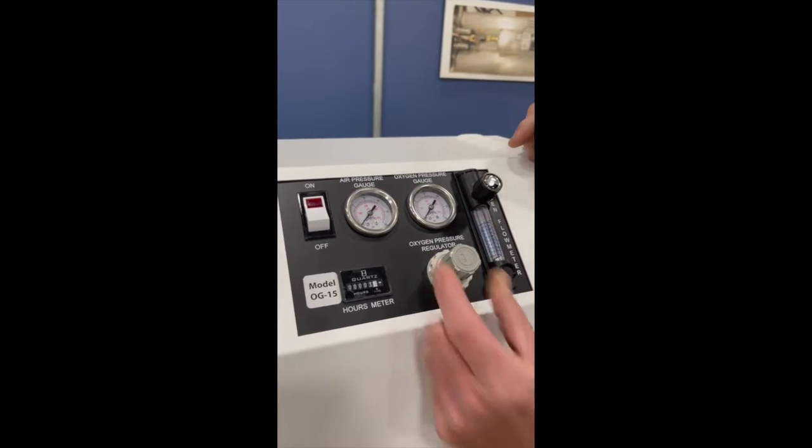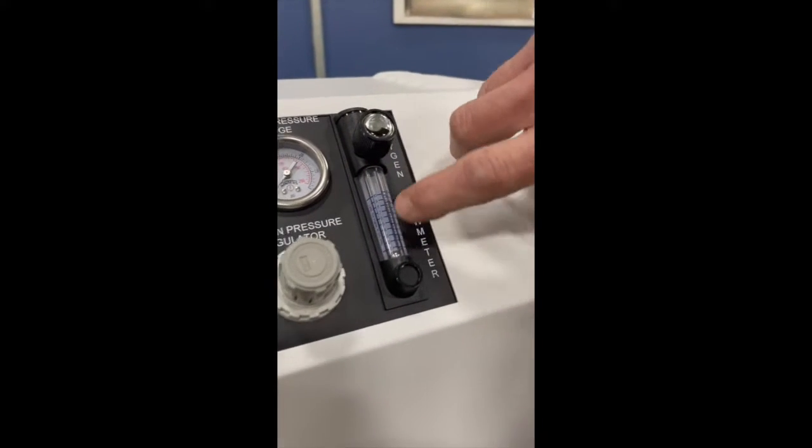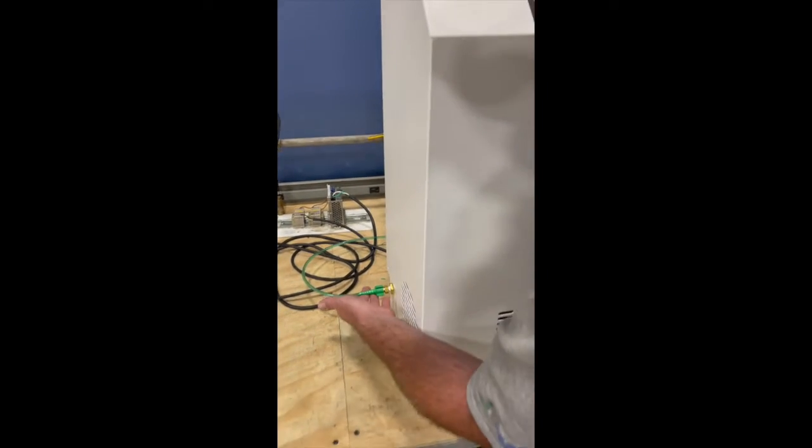This adjusts our output pressure. We have an oxygen flow meter that does SCFH and liters per minute, so whichever units you're more comfortable with. On the side over here is where the O2 comes out — that's your discharge.